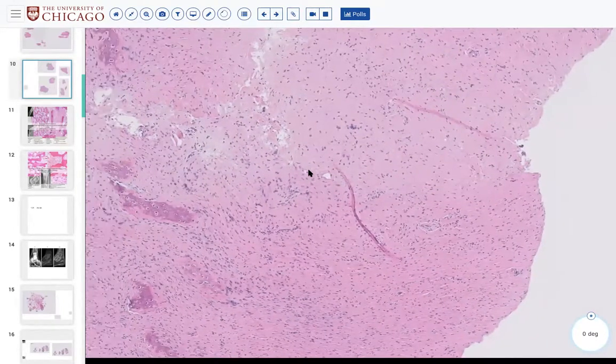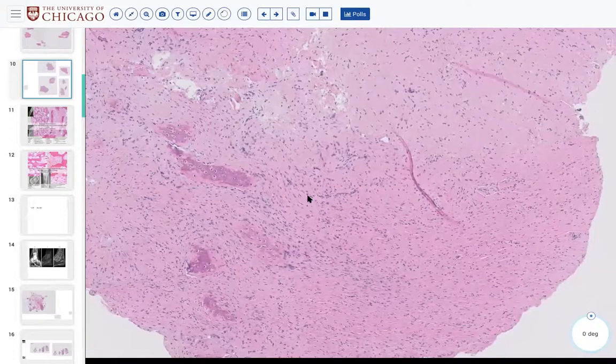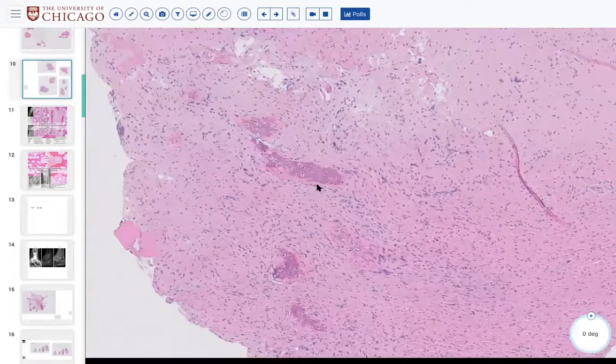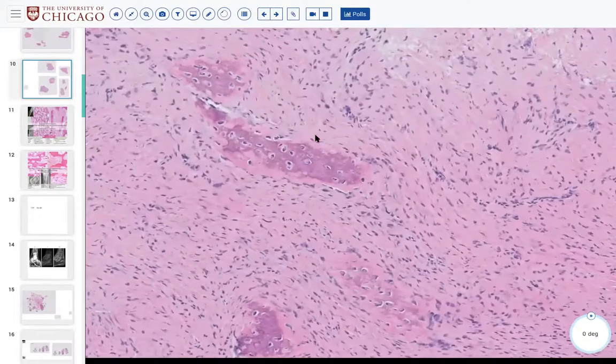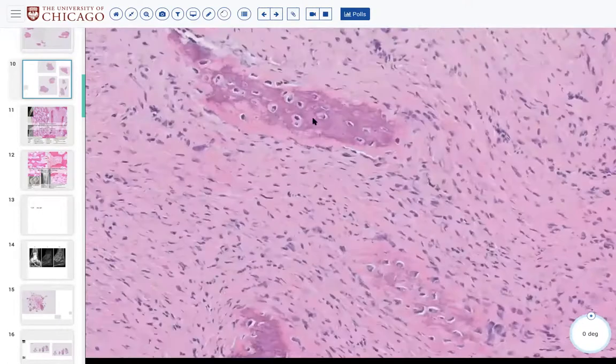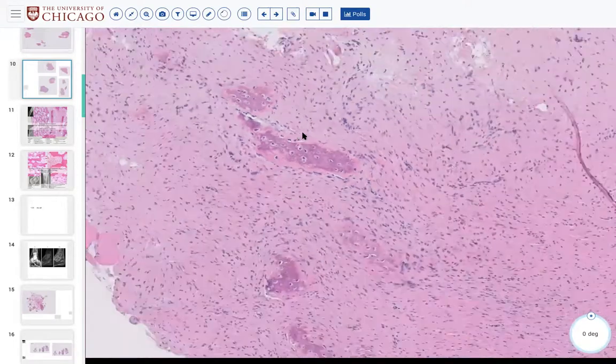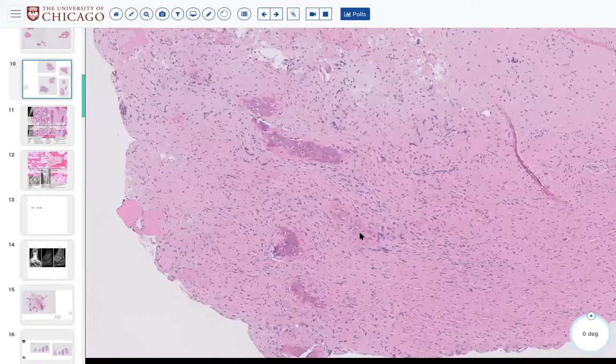Non-ossifying fibroma tends to have a little bit more storiform appearance, with intersecting short fascicles, almost like a dermatofibroma or a fibrous histiocytoma of bone. That's how I like to think about that. Really without much bone. In this case, the bone is very sparse, but it in fact is there. It does appear to be woven, hence lesional. So not really storiform, bone is present.